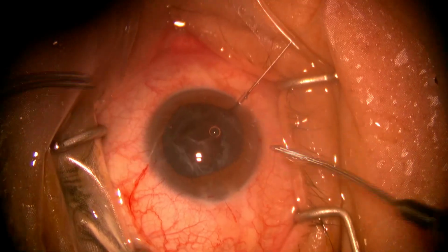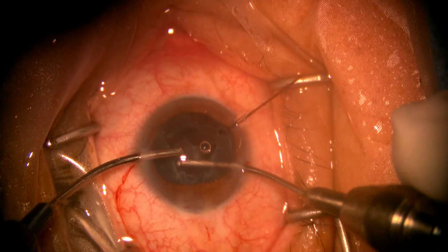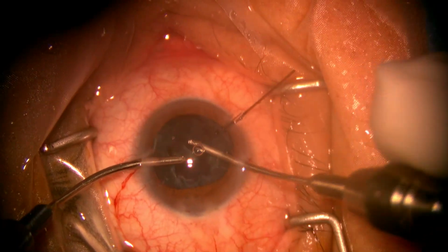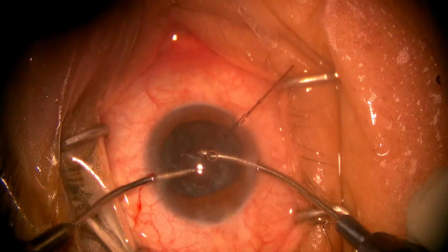Anterior chamber is formed, and after that bimanual irrigation and aspiration of leftover cortical matter is being done using an irrigation and aspiration cannula.